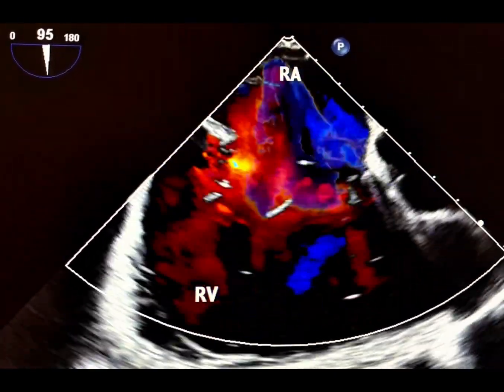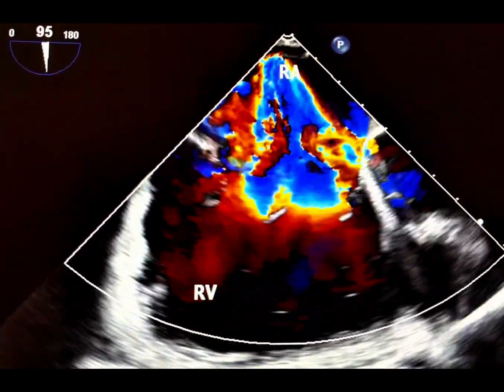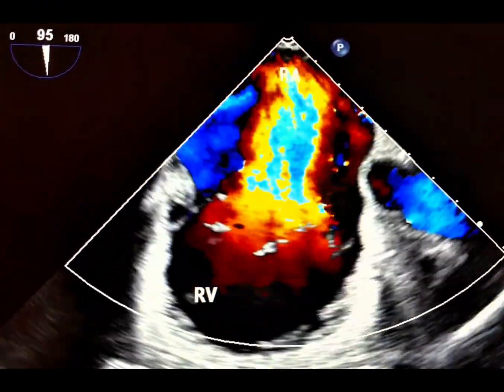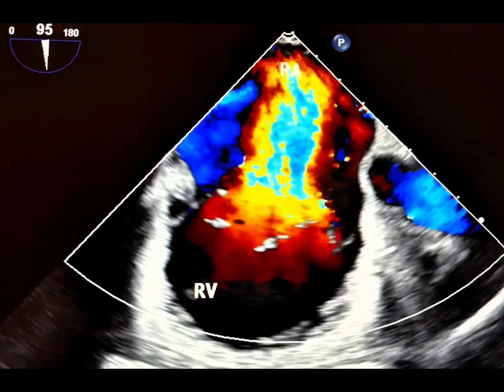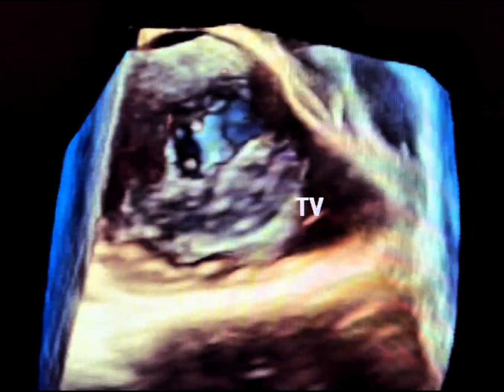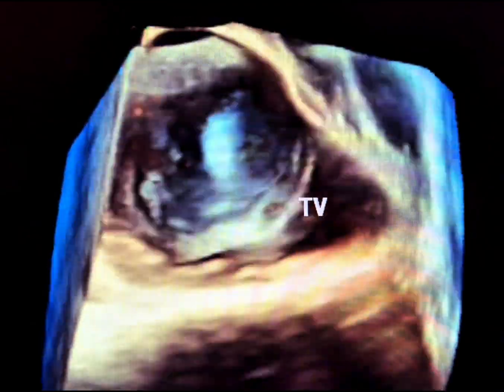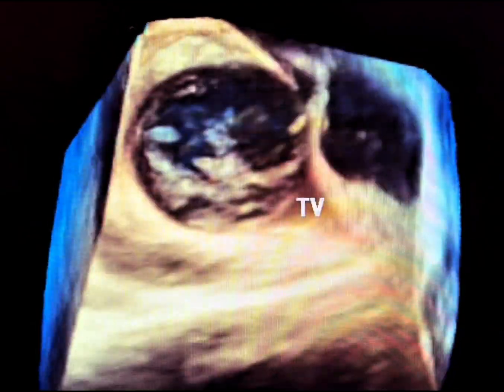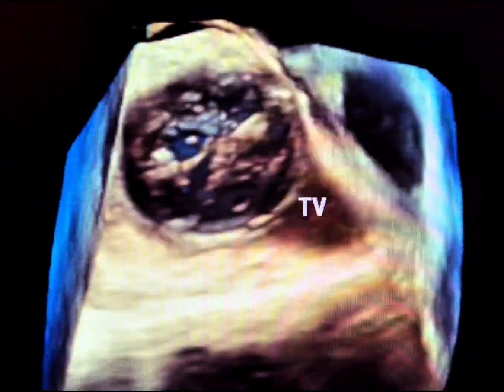Severe TR leads to chronic RV volume overload, progressive RV dilation, atrial fibrillation, and eventually RV failure. This is a 3D view of the tricuspid valve from the right atrium. 3D echo is particularly helpful in distinguishing traumatic leaflet avulsion from other causes such as infective endocarditis.